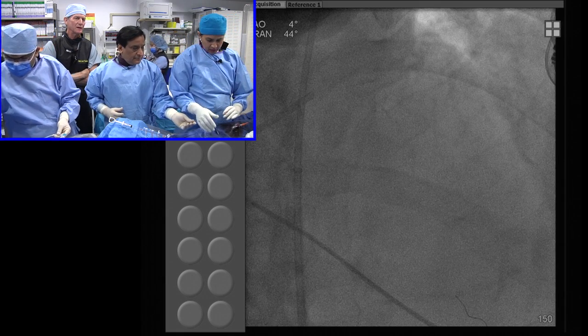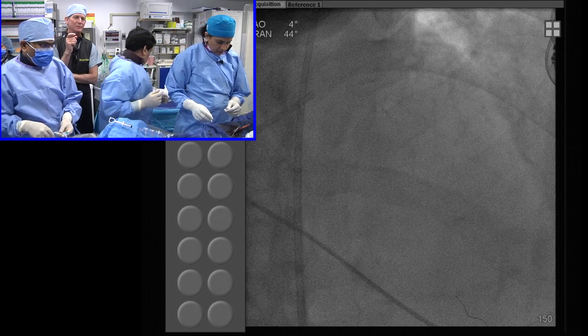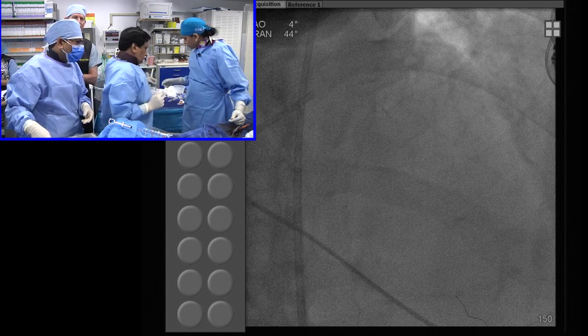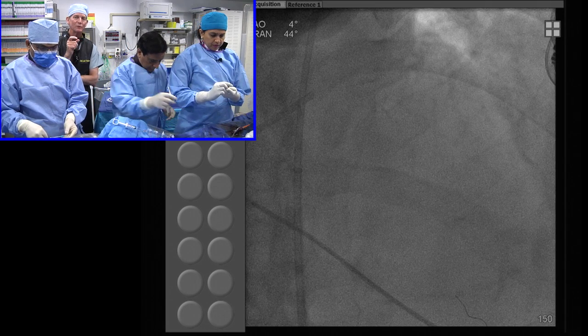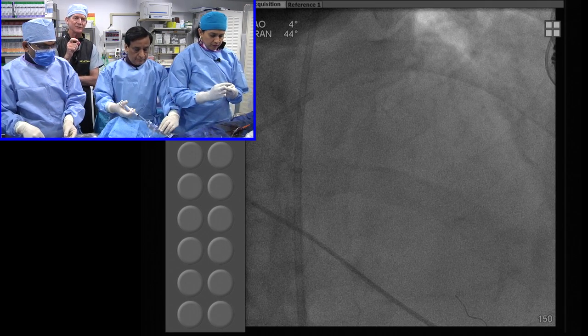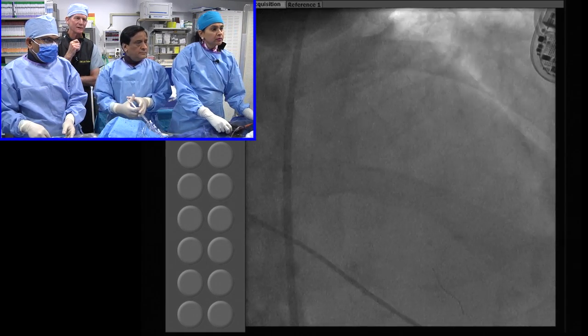And that's something I like to stress also for obstructive lesions, that obstructive lesions that cause ischemia are a temporary problem. Right. You don't need a permanent implant for a temporary problem. We didn't need it with balloon angioplasty. We never would have abandoned balloon angioplasty if we hadn't had abrupt closure and restenosis, right? Because no one wants a permanent implant necessarily.